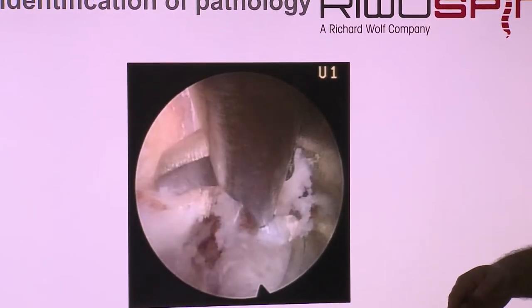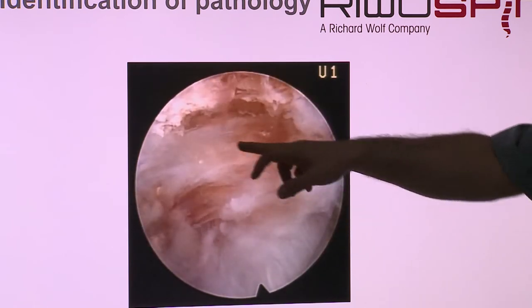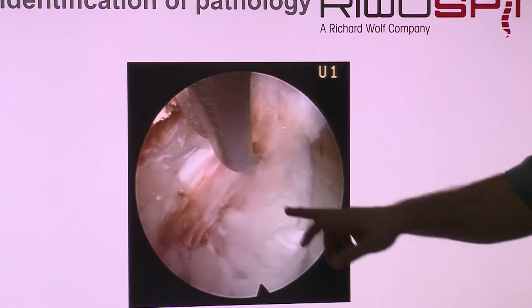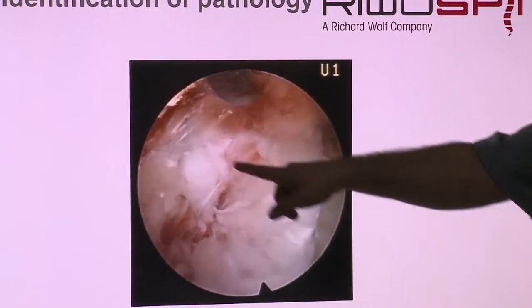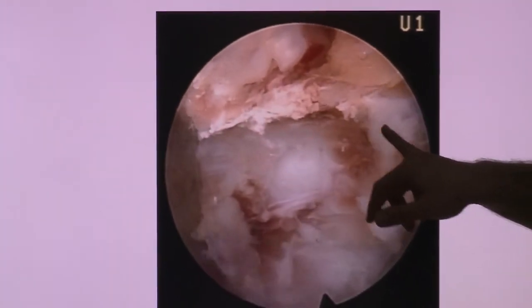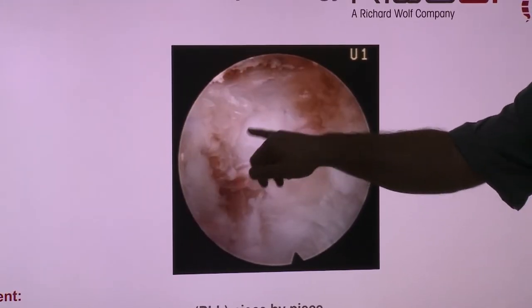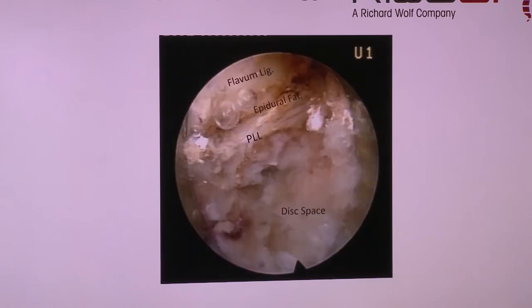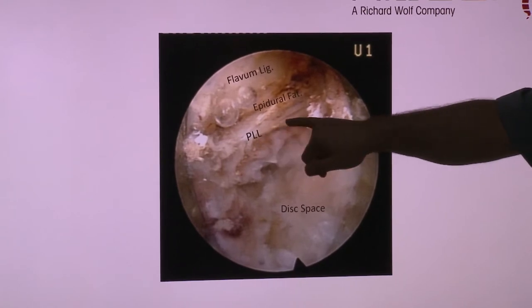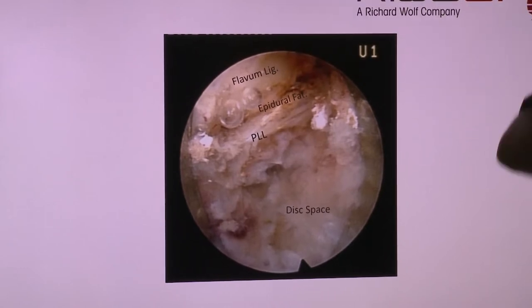Again, we go like this. Then the last layer here, when you cut it, you see. Then you find the herniation here. No, this is not flavum. This is PLL. This space, posterior longitudinal ligament, and also this is the fragment here. Like this, then we remove the fragment. When you remove the fragment, you see the rest of the PLL here, epidural fat tissue, and now the flavum located medial to the facet joint.